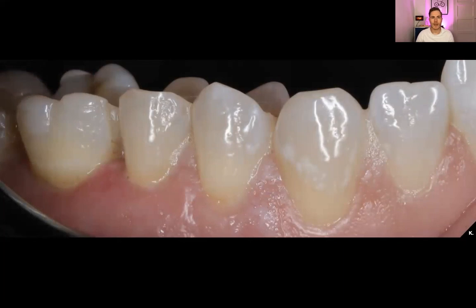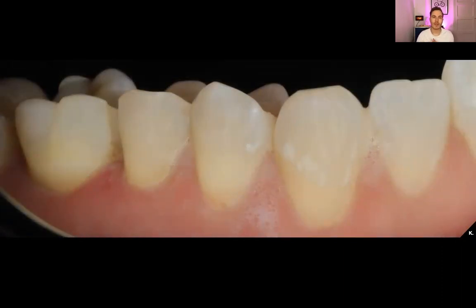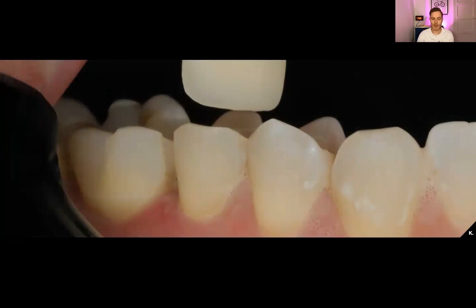Since I was already planning that this could turn out to be indirect restorations, I always start with taking my shade photos. I used a black contrastor and a black cheek protector and made photos in a normal way, but also with a cross polarization filter. The cross polarization filter takes out all the glare so we can see more of the real color of the tooth — a really helpful tool to show to your dental technician. I also take the same photos with a shade tab; in this case it was an A2 shade tab. In the cross polarized picture you can see that it's a fairly good match, and all these pictures I sent to my dental technicians so they have a sense of what's going on.